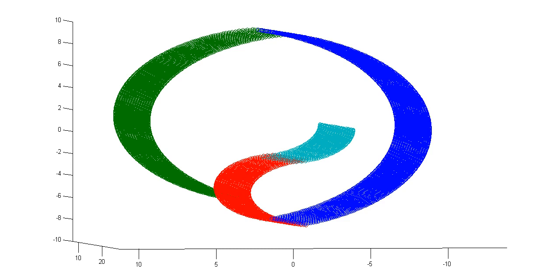So there's not a good way of getting fine temporal resolution using fMRI, but the spatial resolution, meaning how detailed these different blood levels are across the brain, is considered pretty decent, about 2 millimeters.